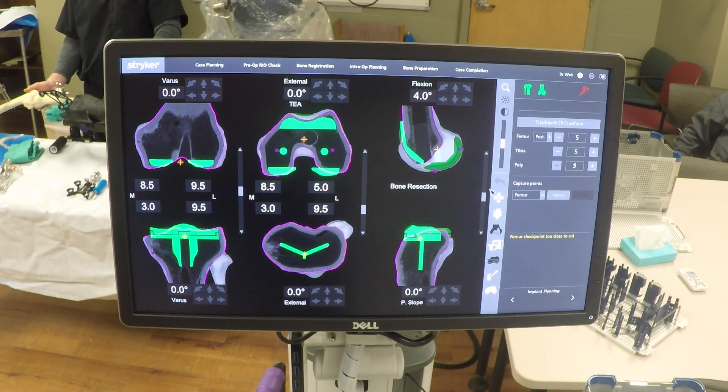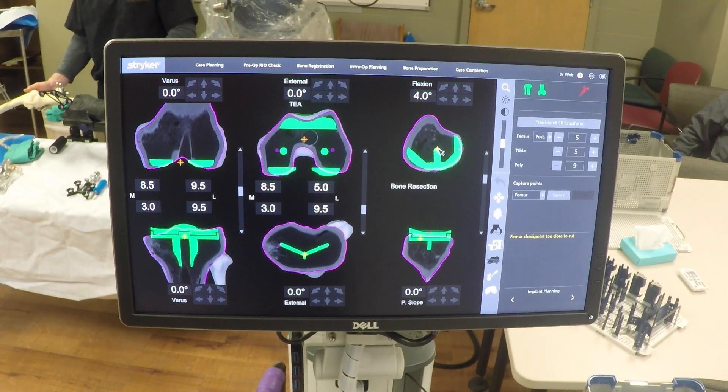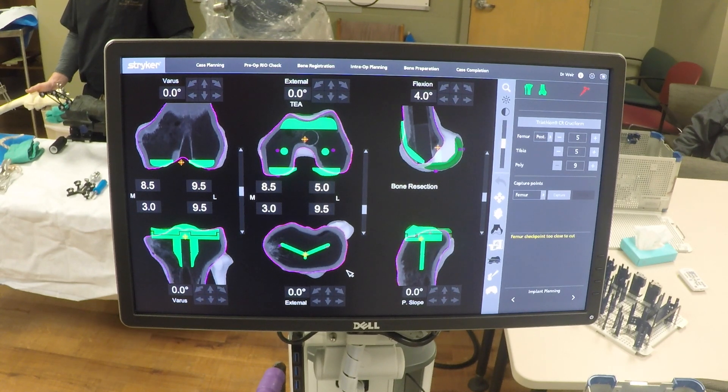The final step for preoperative planning is to set your trochlear flexion. We anchor at the tip of the medial peg and then scroll through to the trochlea until we find a fit we like. That is the known starting point for RoboTotal. Every case starts there, and by inputting our gap values, RoboTotal can then run all possible combinations of implant positions and help you pick the best one.